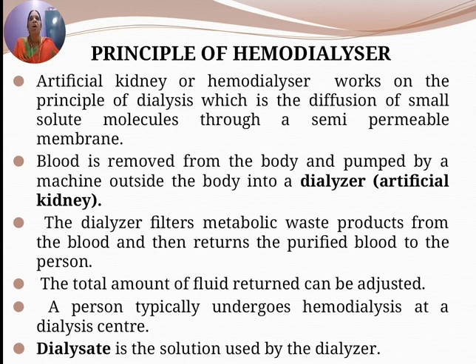So, the principle of the hemodialyser. The artificial kidney, or hemodialyser, works on the principle of dialysis, which is the diffusion of small solute molecules through a semi-permeable membrane.